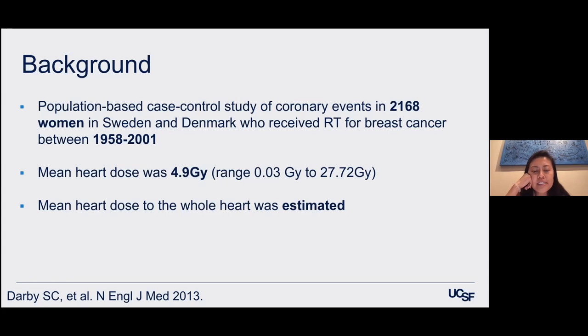And then we do a CT scan in which we basically slice your body into 3 millimeter slices. And then Dr. Park, Dr. Prionis, and I, we draw out on every single 3 millimeter slice what we want to treat and what we want to protect. In this way, we know accurately what the mean heart dose is. We don't have to estimate it.